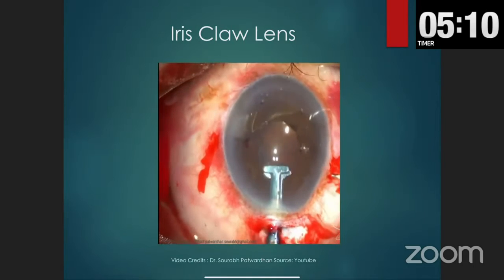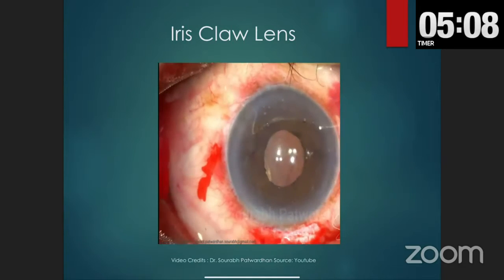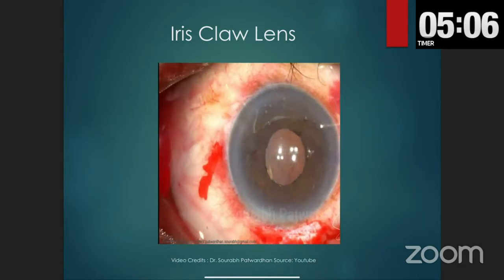But if you have a case which is problematic, when you think you might need to place an iris claw lens, it's always better to have one, or get it ordered and keep it with you.